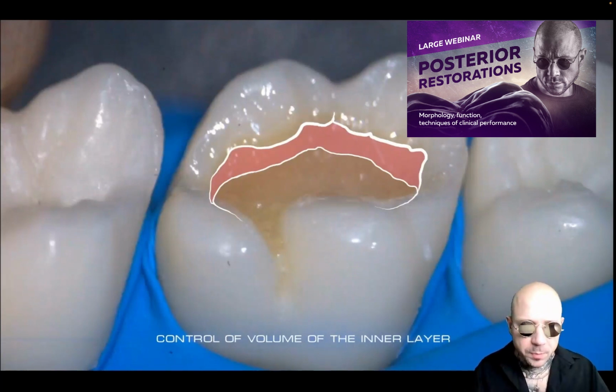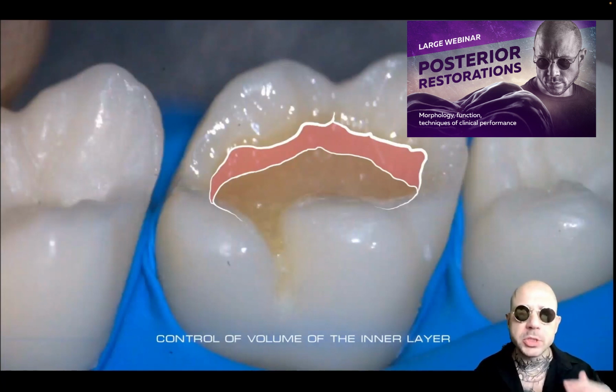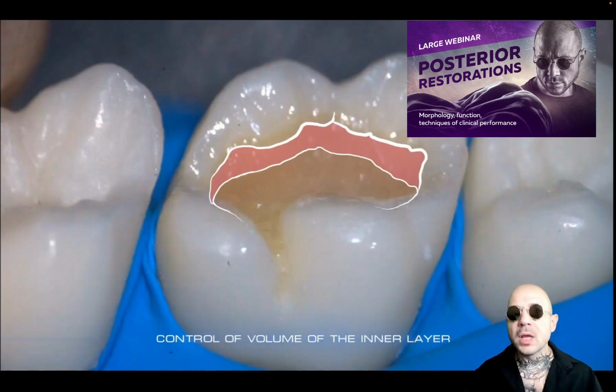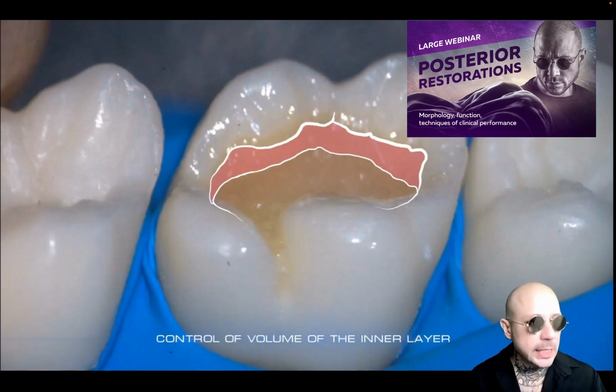Stop to be visible. We will have to add more and more volume of composite to the same place, and the final portion we'll have to work with will be very big, and the bigger the portion is, the less controllable the process of modeling. That's the simple truth we need to constantly keep in mind, but that's not the biggest problem.